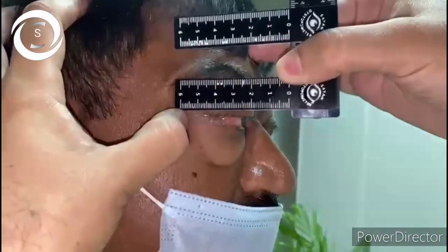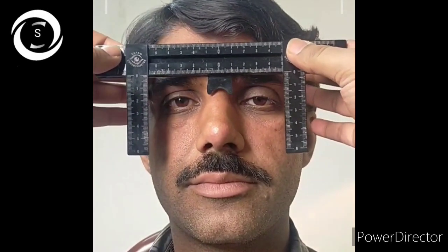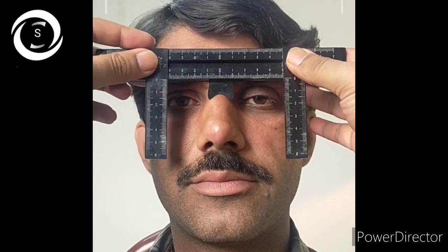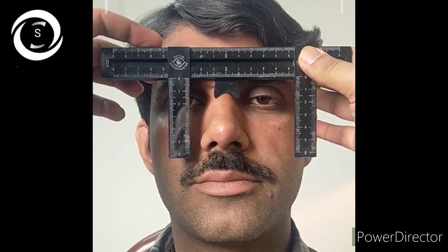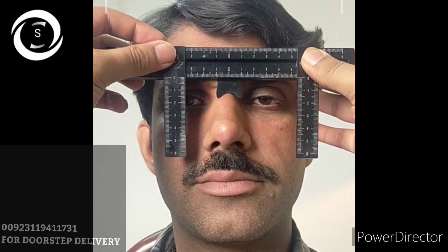So you can measure dystopia, horizontal lid laxity as well as anisocoria or pupillary size with it. I would like to suggest to the inventors that for pupil size they can make circles of varying sizes in the vertical scale that will ease the measurement of anisocoria and pupil.